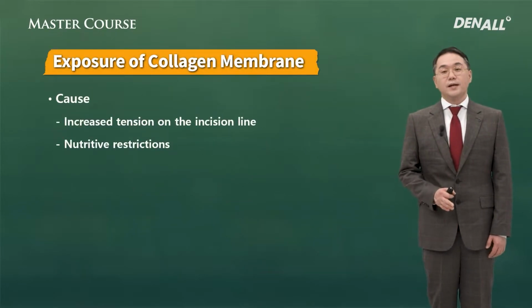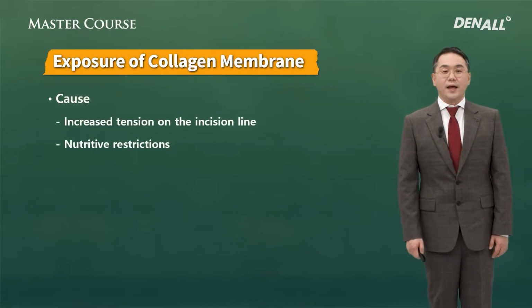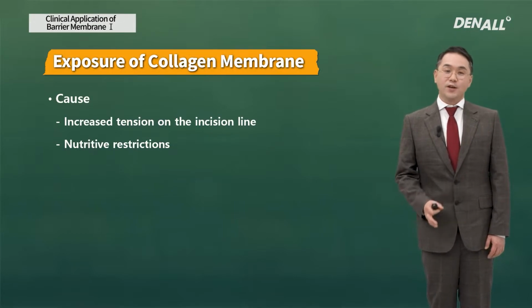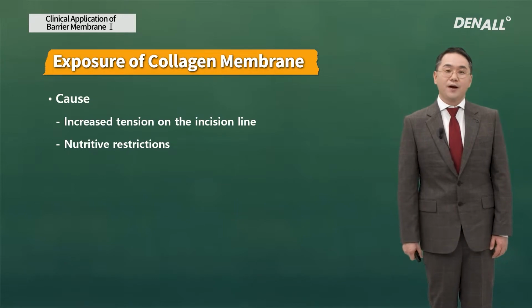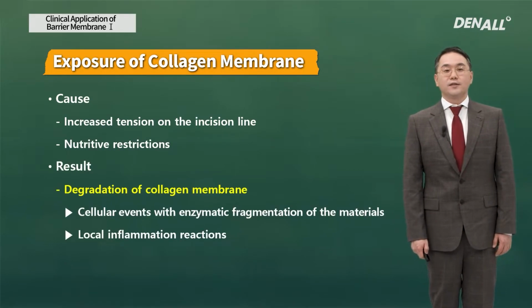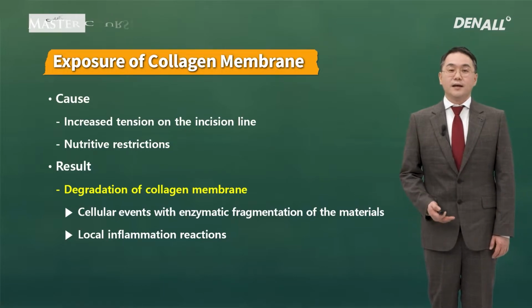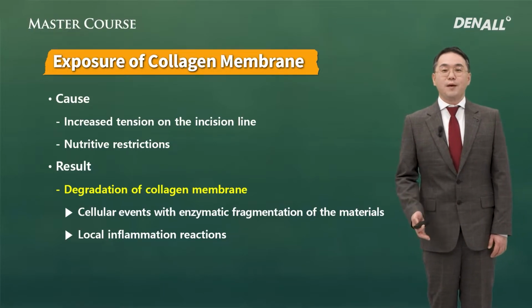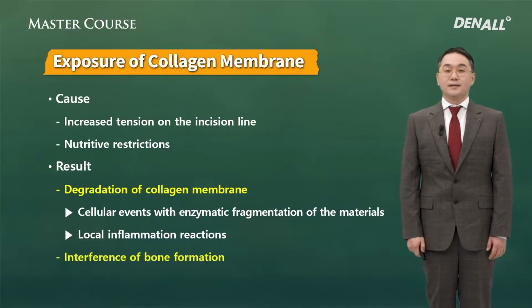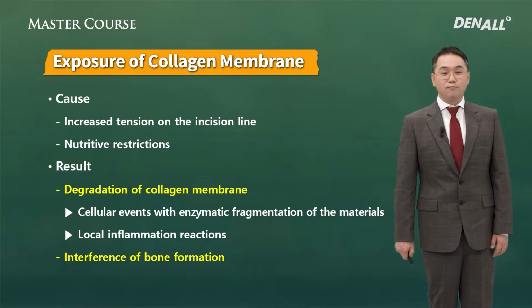However, regardless of the cross-linking, collagen membrane has a disadvantage: lack of space maintenance. When it is exposed, it is degraded and it cannot work as a barrier membrane. Once the collagen membrane is exposed, it no longer serves as a barrier membrane, interfering with the bone regeneration below.